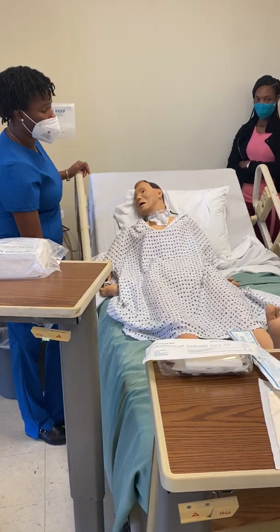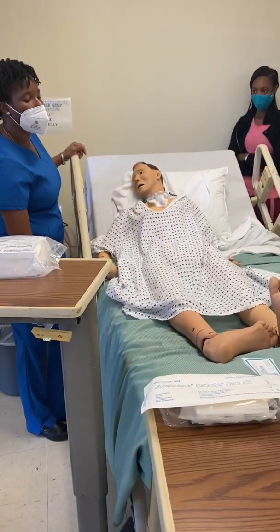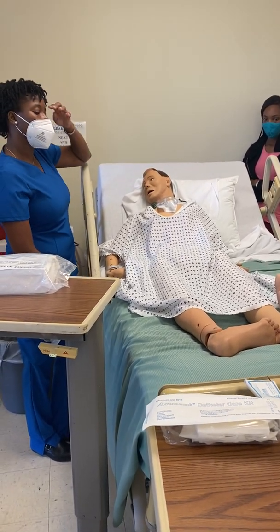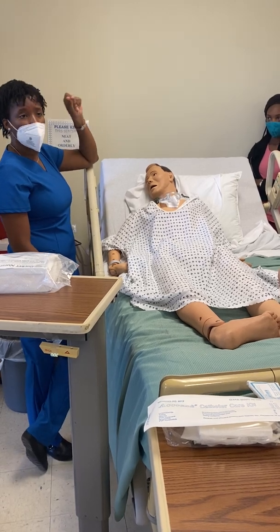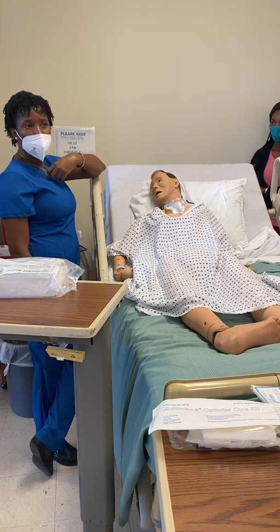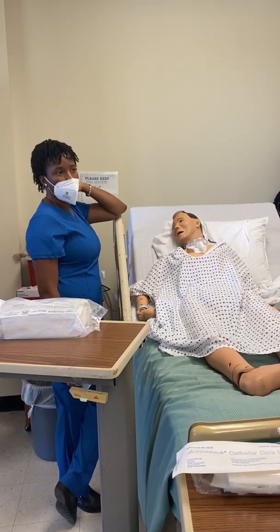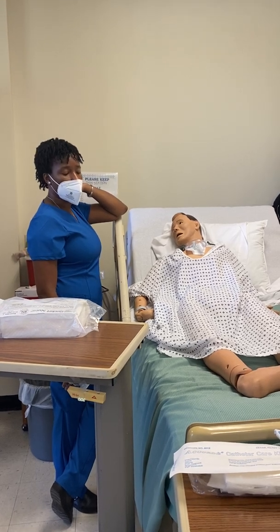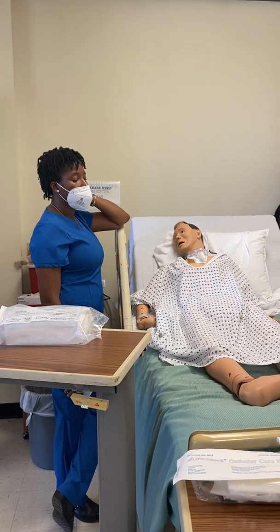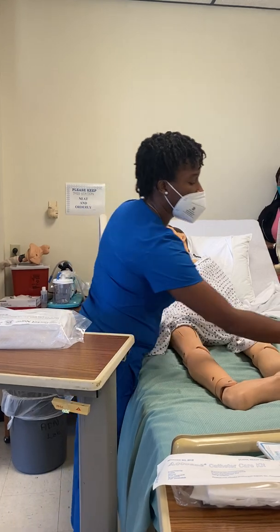I do not know if you're gonna have to do draping or not with the sheet. In the past few semesters, we have not made students do that because sometimes it's just more risk for messing it up. I'm just gonna be honest with you, okay? Or contaminating easy. So you don't have to use the drape, but I'm gonna show you how to use it, okay?